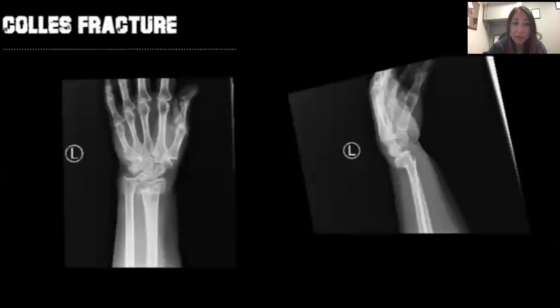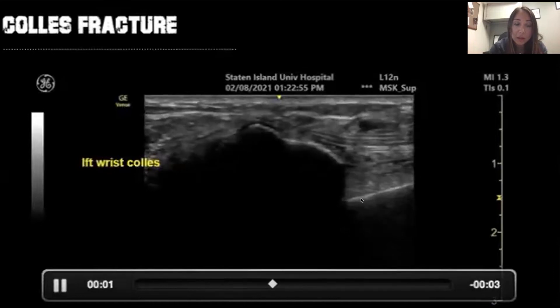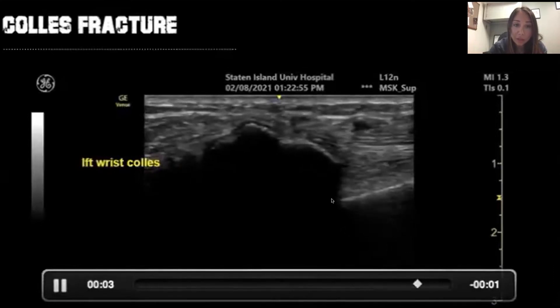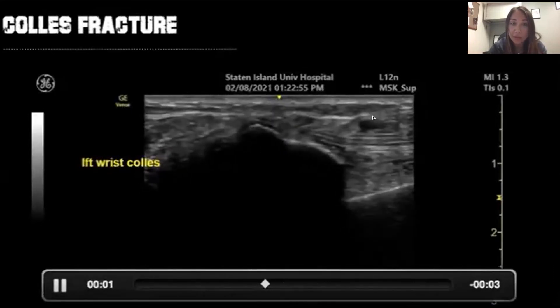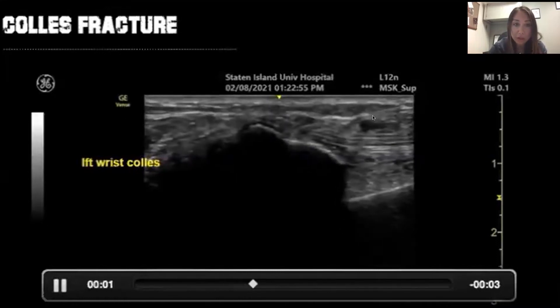On x-ray, this patient had a Colles' fracture, which is a distal radius fracture. You can see here that this is the distal radius, and right there is the separation. X-ray is very useful to diagnose fractures and dislocations.